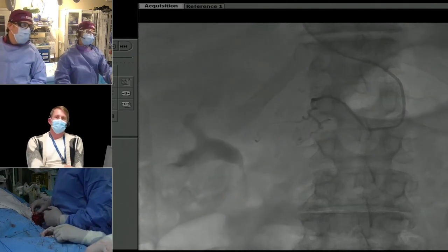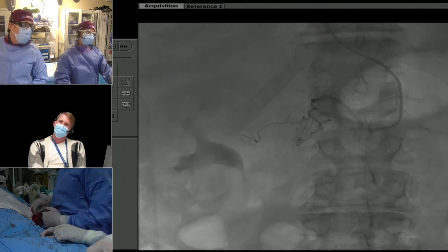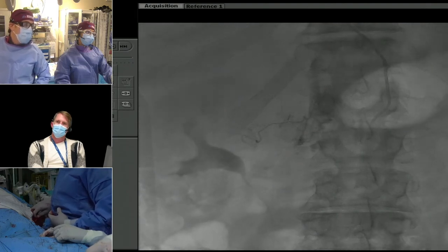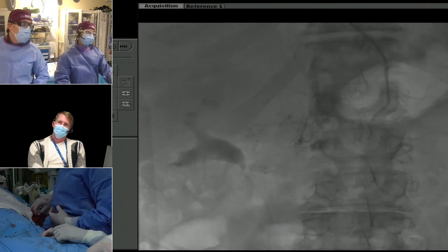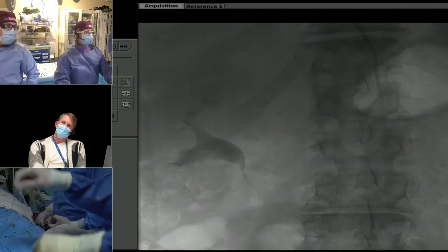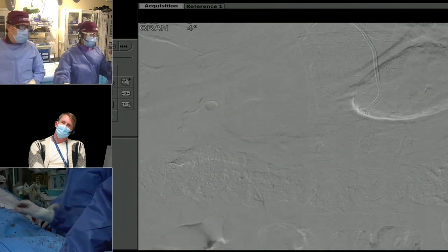So you guys are definitely seeing the issues with aortic tortuosity, because I knew initially that this would be a challenge. He had that steep arch coming forward that we had to use the Simmons for. It's just one of those days. Oh, look at that. Let's use the glide wire for this. Nice work.